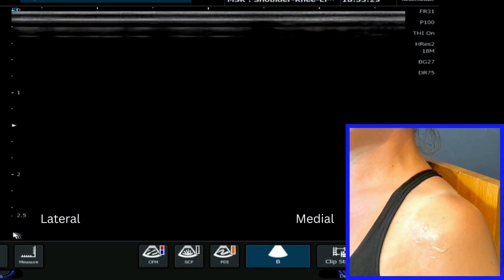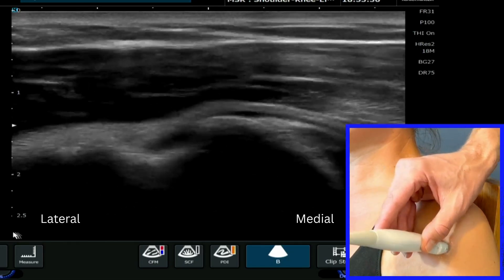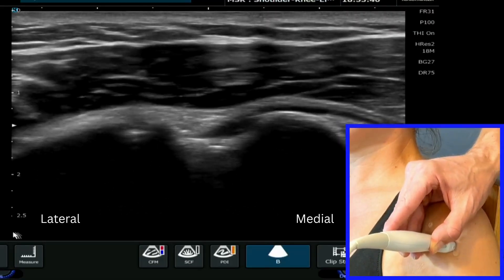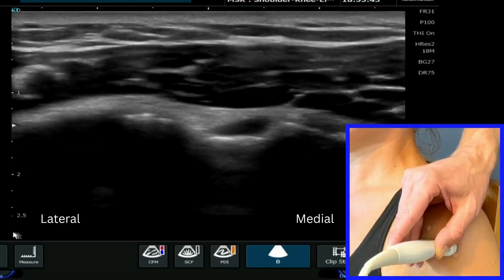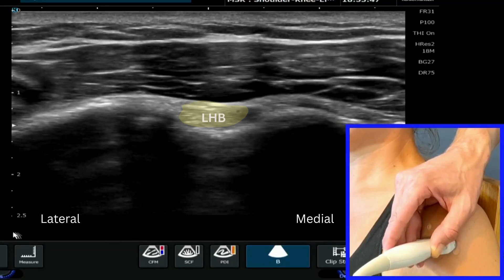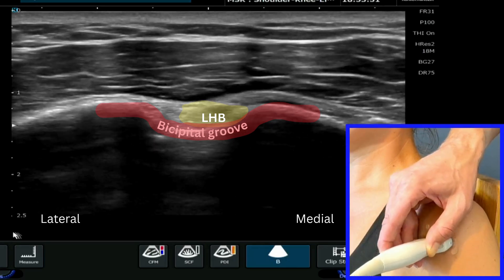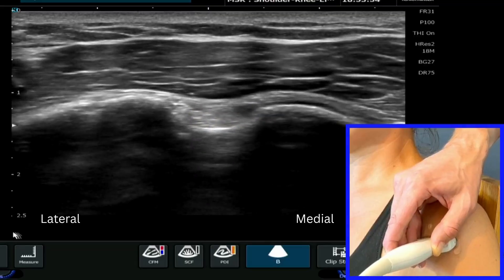We're now going to have a look at the rotator interval on ultrasound. We're going to start off with our arm in neutral as we would do for any shoulder scan, and we're going to find that distinctive landmark which we can see in the middle of the screen here — the bicipital groove. We can tilt our probe, as we've seen in the other videos, just to make sure that we are seeing the biceps tendon there nice and bright.